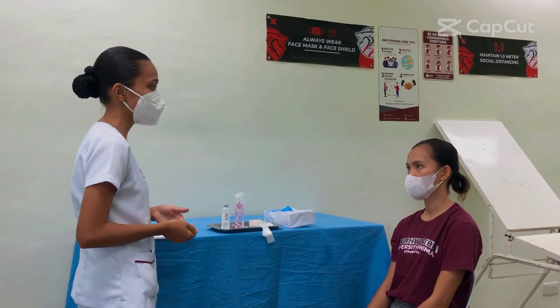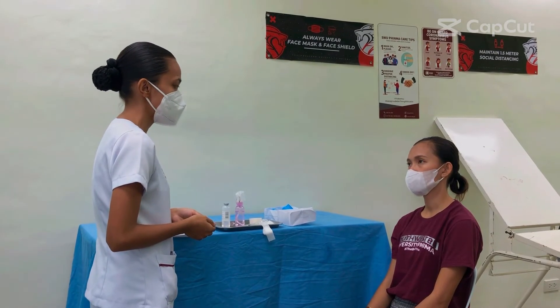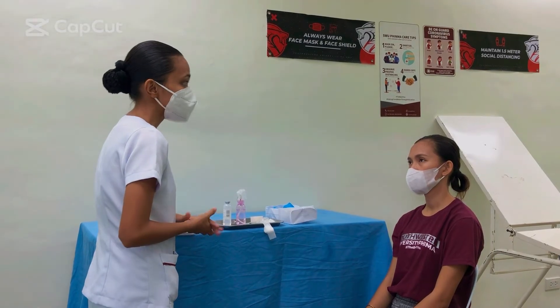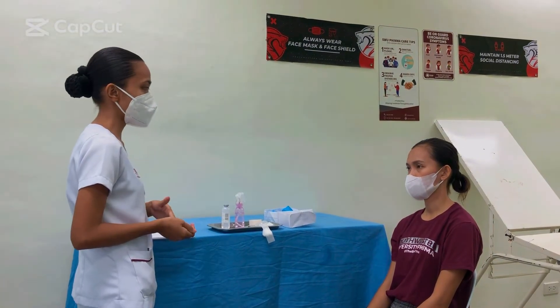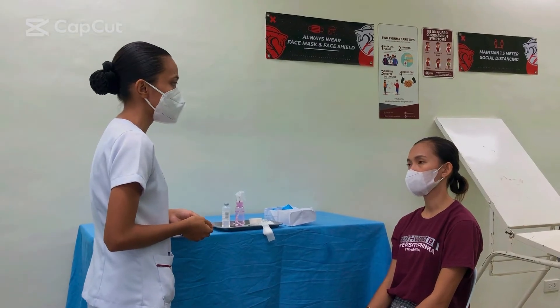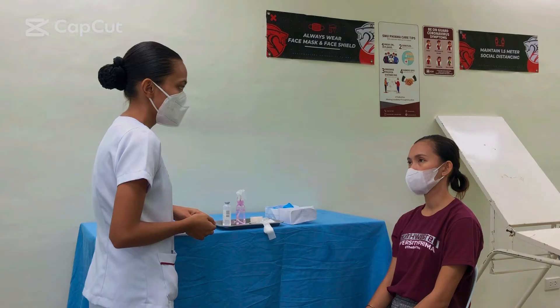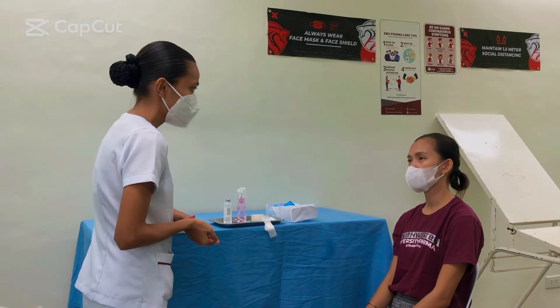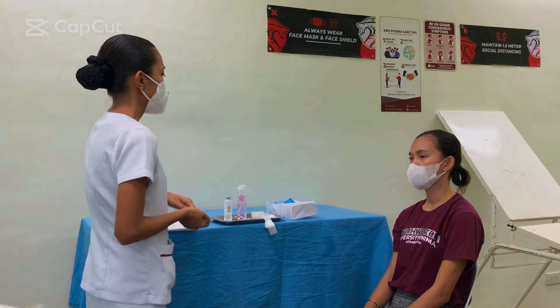Explain the steps of the procedure and tell the patient that the injection will cause a slight warning or sting. Mom, for today I will administer medication intramuscularly. It may cause some discomfort, but it is tolerable.